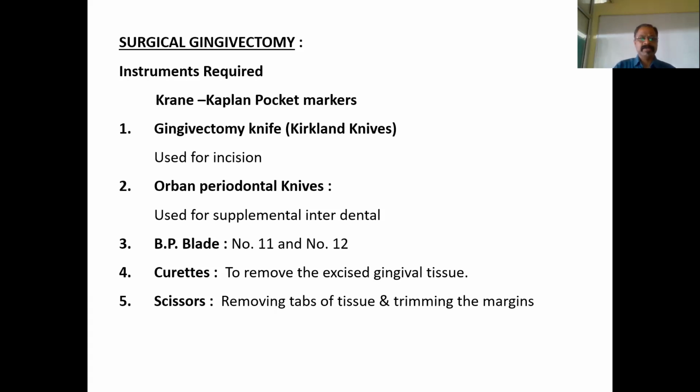Along with that, you can use a blade number 11, a blade number 12, or a blade number 15 as well. Then you're going to use curettes once you excise these tissues.